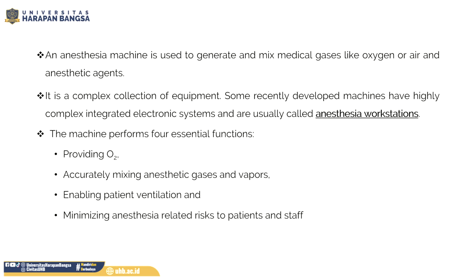This machine performs four essential functions: to provide oxygen, to mix anesthetic gases and vapors, to enable patient ventilation, and to minimize anesthesia-related risk to patients and staff. So the anesthesia machine here is used for respiratory support and anesthetic agent administration.